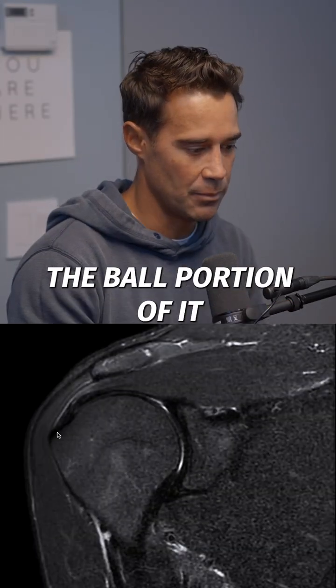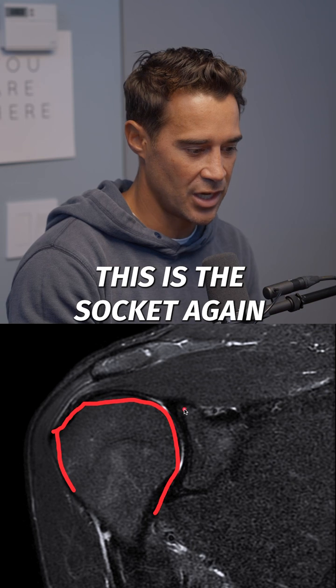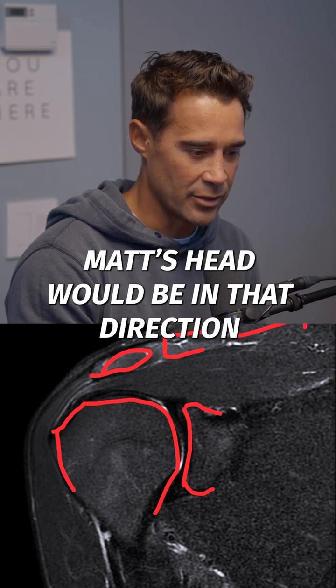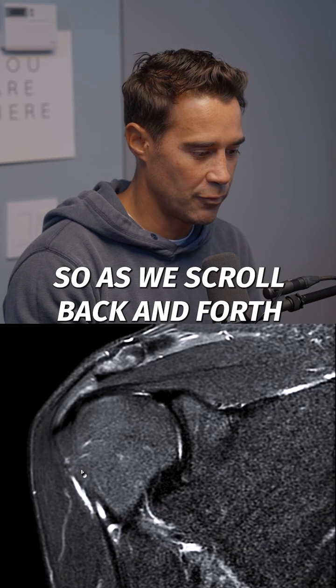What we're looking at here is the humeral head — the ball portion of the joint — and this is the socket. Using the golf ball and golf tee analogy, this is the top of the joint we call the acromion, with the clavicle coming this way. Matt's head would be in that direction and his left shoulder would be over here in this direction.